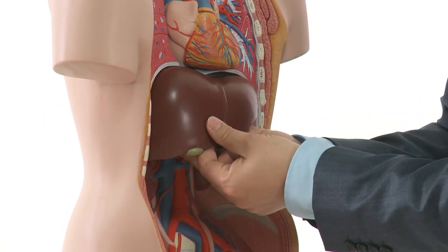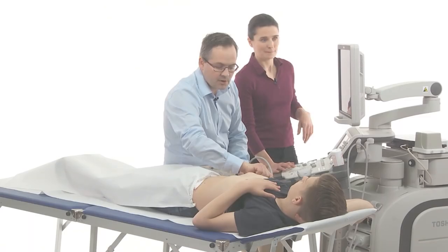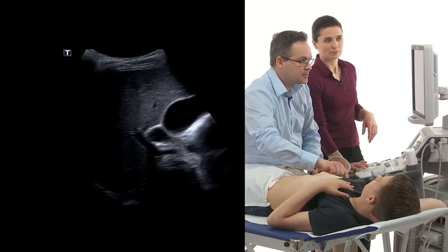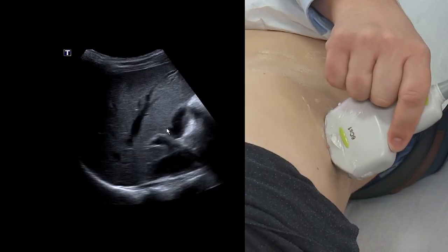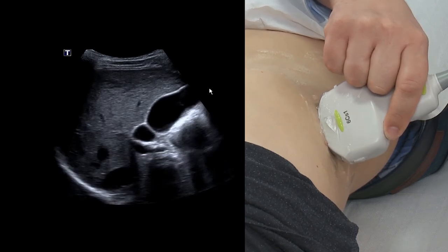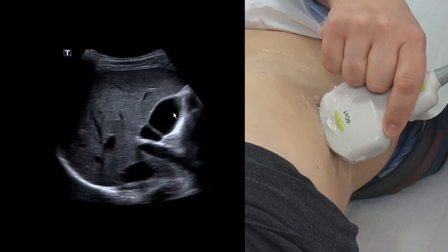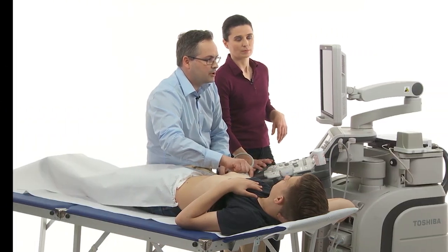So we can easily detect the gallbladder over here. I place the probe in between the ribs in this intercostal space and tilt the probe upwards and downwards to find the gallbladder. Here it is already. Yes. Beautiful to see. So we can answer the question whether there is a stone or inflammation also on the intensive care unit. In essence, it's your decision which view you choose. Remember, there are many roads that lead to Rome.